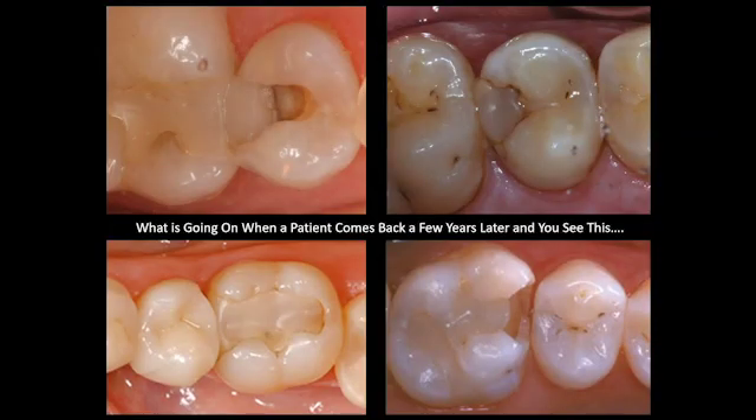The last thing we want to see in a hygiene recall patient when we go into the operatory to do that hygiene check is a composite that's worn out like butter, or a composite where the margins are not adapted very well to the tooth structure, or a composite that has just broken because it's not strong enough to maintain some of the occlusal forces.